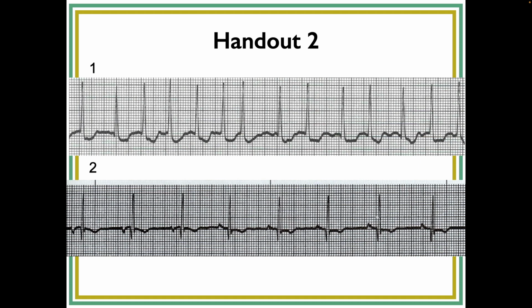So first of all, when you get to the point of irregularly irregular, this light should flash in your head. Consider AFib, okay? And in AFib, the isoelectric line tends to be wild, okay? Lots of fib waves bouncing around.